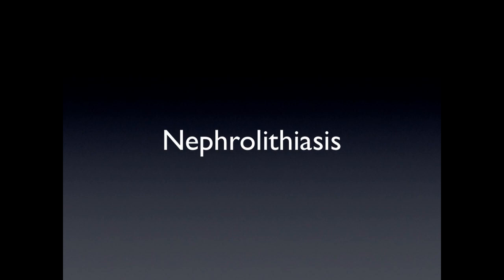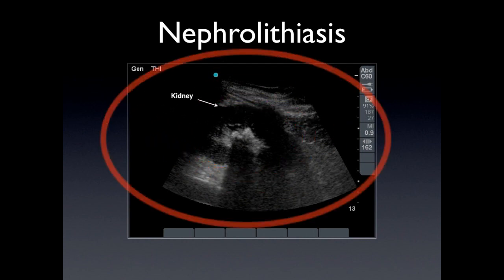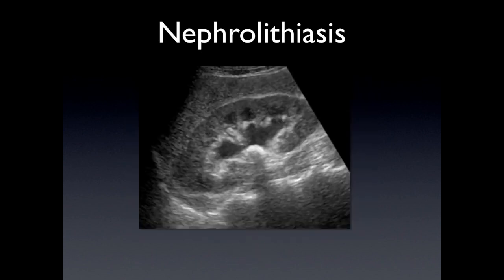Nephrolithiasis. We're unable to see stones that are within the ureters, but within the kidneys we will be able to identify stones. In this case, you'll see the kidney here — there's a cortex, and you have two hyperechoic structures in the middle. You know that there are stones because you have an artifact — in this case, a shadow behind the stones. That's a clean shadow, signifying the presence of a stone. In this case, you are also able to see there's a little bit of hydronephrosis, with a stone there and a shadow behind it.